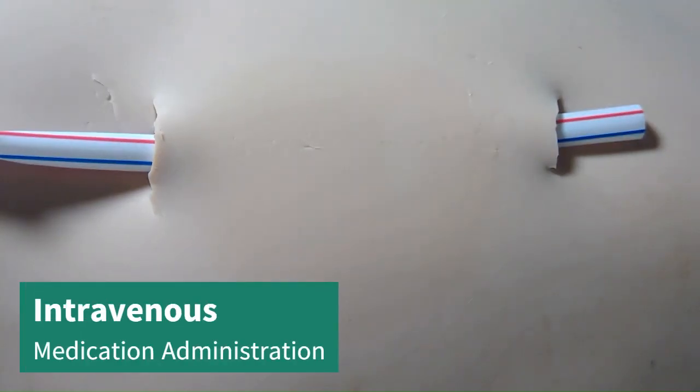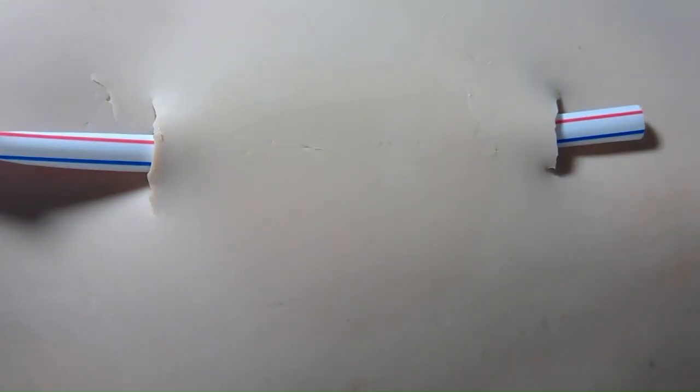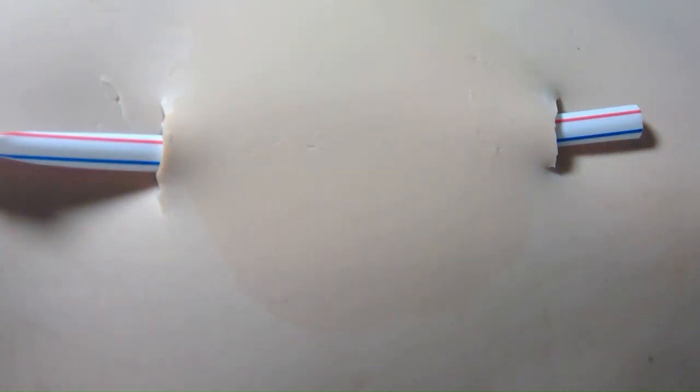Next we will teach you how to start an IV. To start an IV we're gonna begin by sterilizing the area with our alcohol prep pad in a circular motion. I'm going to demonstrate using an 18-gauge IV catheter, so we're gonna open the catheter.